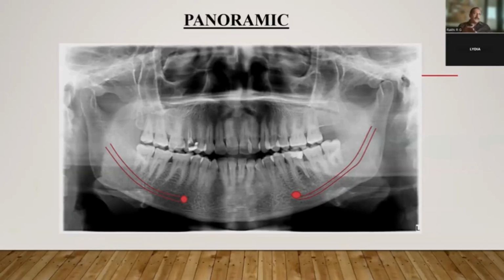Yeah, we have come across a few articles wherein they have done hemisection and placed an implant in that region, and connected that hemisected tooth root area with the implant to the other fragment of the same tooth. So that means the mesial is going to be left behind with the crown and the root, and the distal portion has been hemisected and removed, and there you have placed an implant and connected the two fragments of the same tooth.